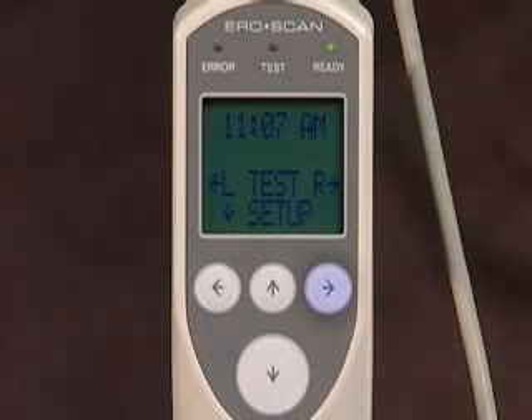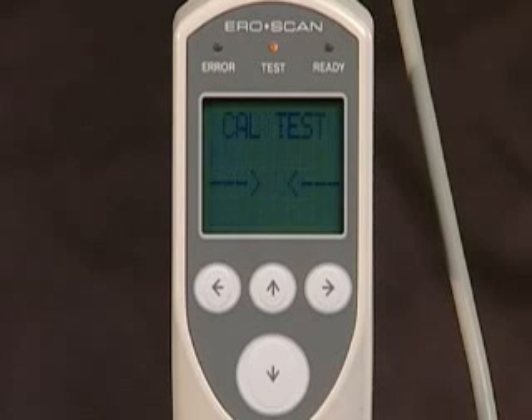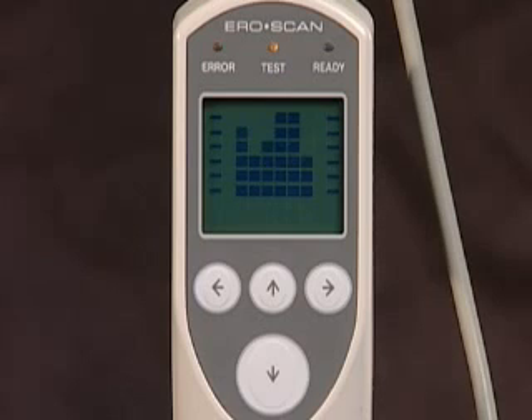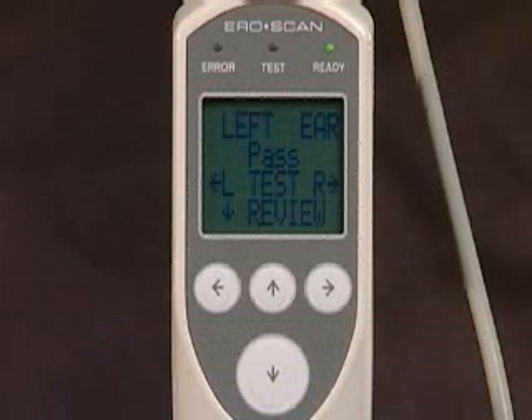Select either the right or left arrow key corresponding to the test ear. The yellow test light will illuminate and horizontal volume and noise bars will appear. The volume bar indicates ear canal volume and the noise bar indicates environmental noise. These bars assist the tester in achieving proper probe placement. Each bar begins at full screen and should decrease to half screen or below before the test begins. The AeroScan will automatically start once an appropriate seal is obtained and a calibration is performed. Following calibration, bars showing test results will appear on screen as the emissions are measured. Testing is complete when the green ready light is illuminated, and the results screen will appear automatically.